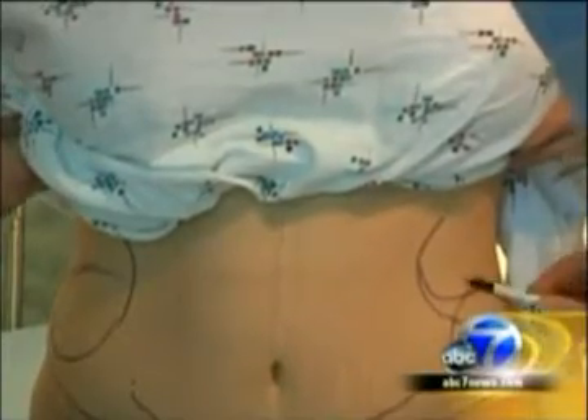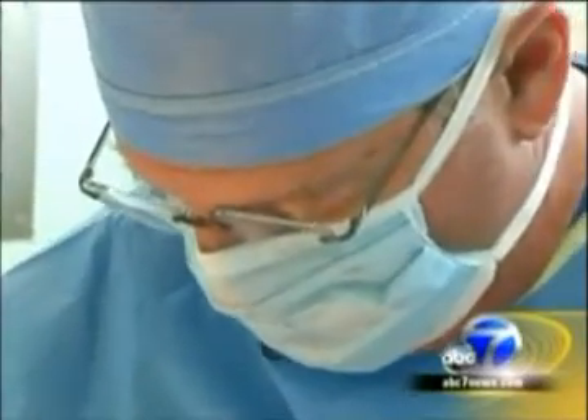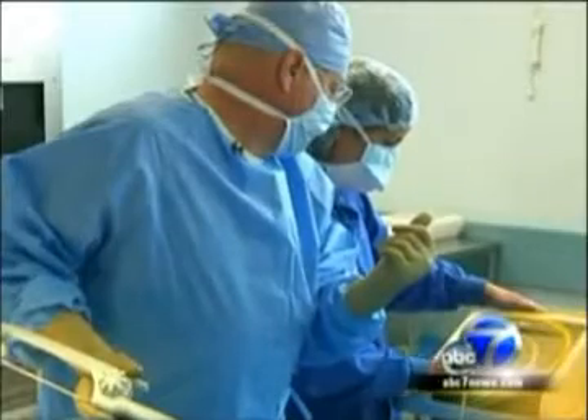At the El Camino Surgery Center in Mountain View, Dr. Rosenberg begins by marking Diana's stomach and thighs. Once in the operating room, he begins with traditional liposuction to clear out larger areas, then switches over to the BodyTite device.